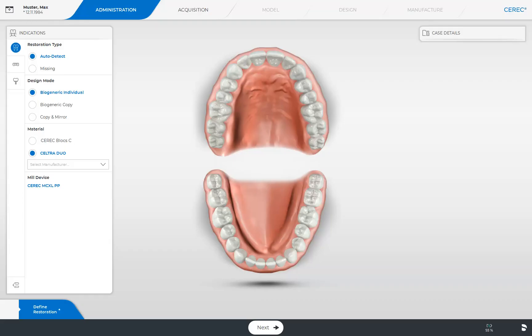After we have entered our patient data, we are automatically moved to the first phase — the administration phase. In this phase, we define the restoration type for the respective patient case. We can select between a single tooth restoration, a bridge restoration, and an implant restoration.